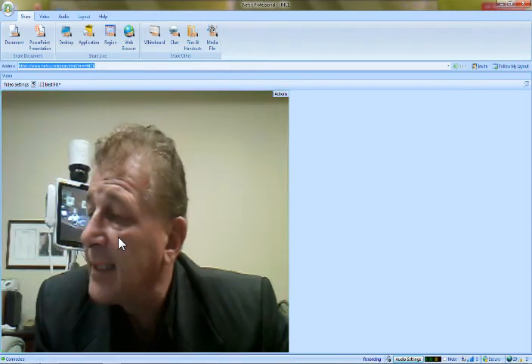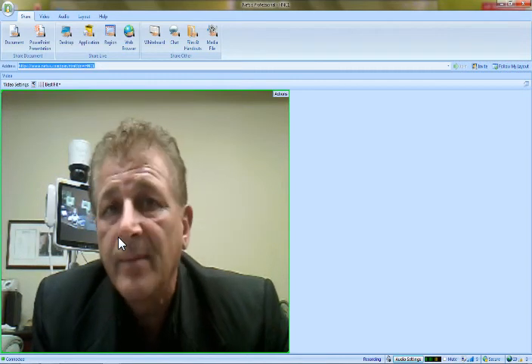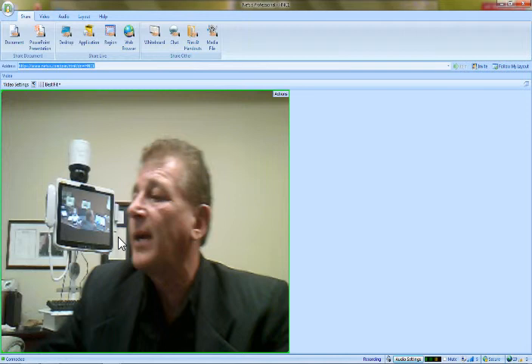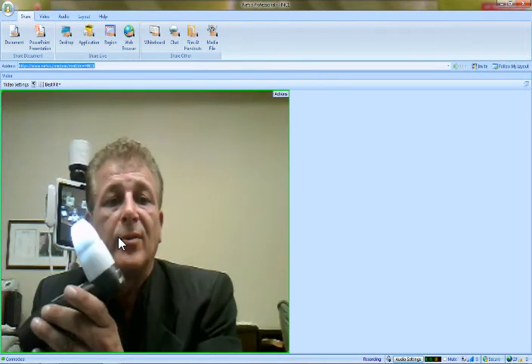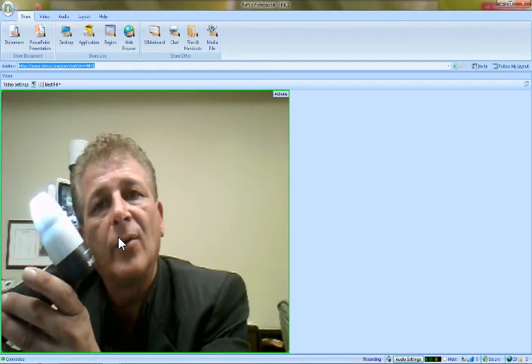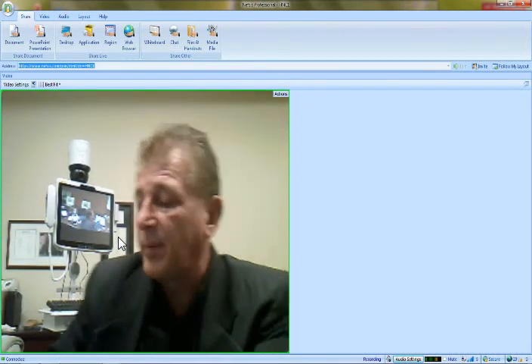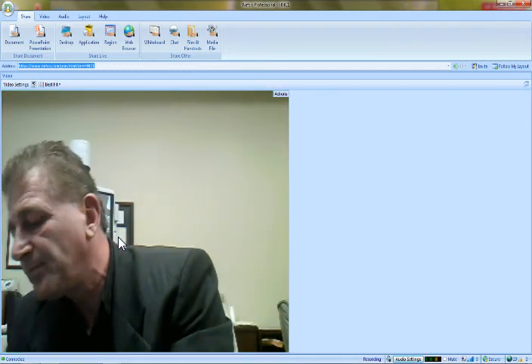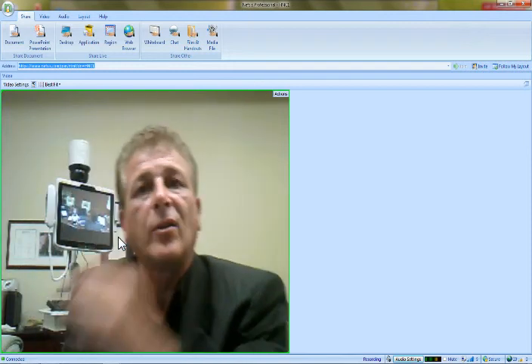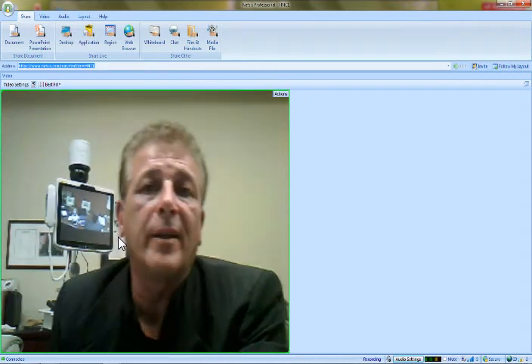Finally, maybe we take a look at microscope cameras and other applications where we can look at dermatology. We can examine patients for wound care and wound recovery. So we take a microscope camera like this, and I can literally use this now to look at my patients, perhaps diabetic, and they're at home and they're going through some wound recovery. Now I can do a very close examination of that patient, and perhaps what I'll do is I'll reach in my pocket and pull a dollar bill out, and maybe we'll bring that up on the screen in just a moment. And then we'll be able to take a look at lesions, at wound recovery, and so forth as well. So that's one of the other applications we can look at.